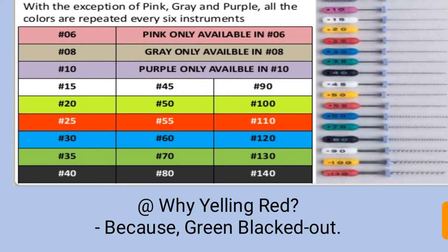From 15 to 60, there are 5 increments. From 60 onwards, there are 10 increments.